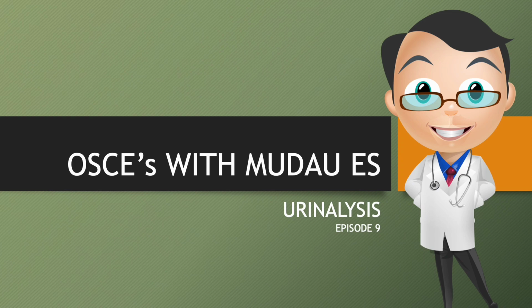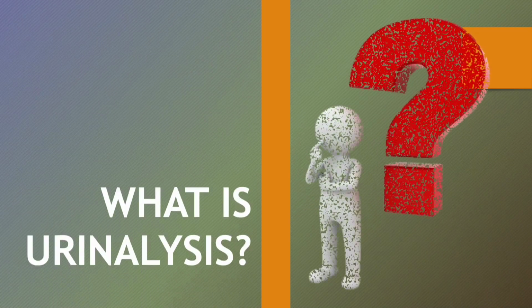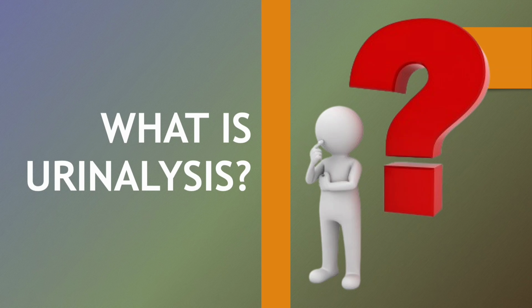Today we will be doing a procedure called urinalysis. What is urinalysis? This is a procedure of analyzing urine's physical and chemical properties to test for the presence of diseases in the body system.